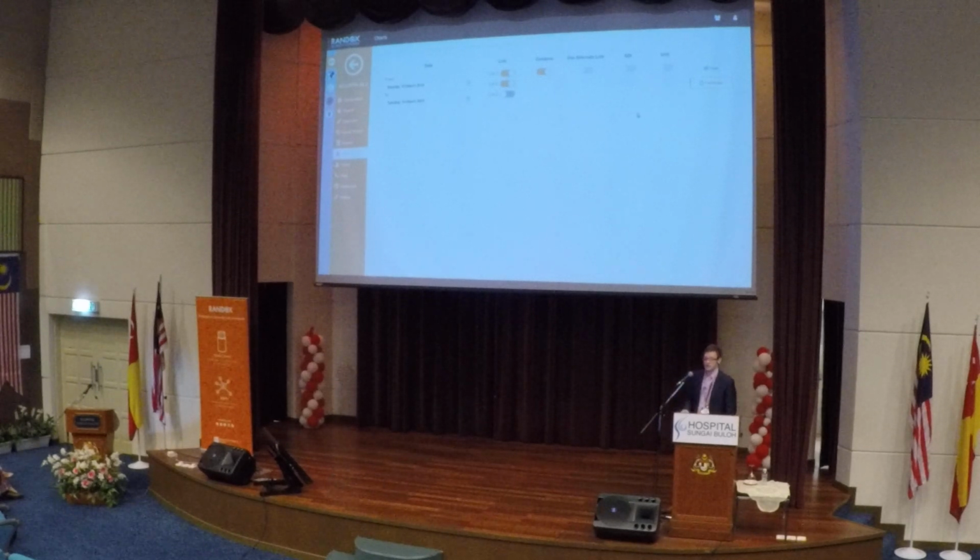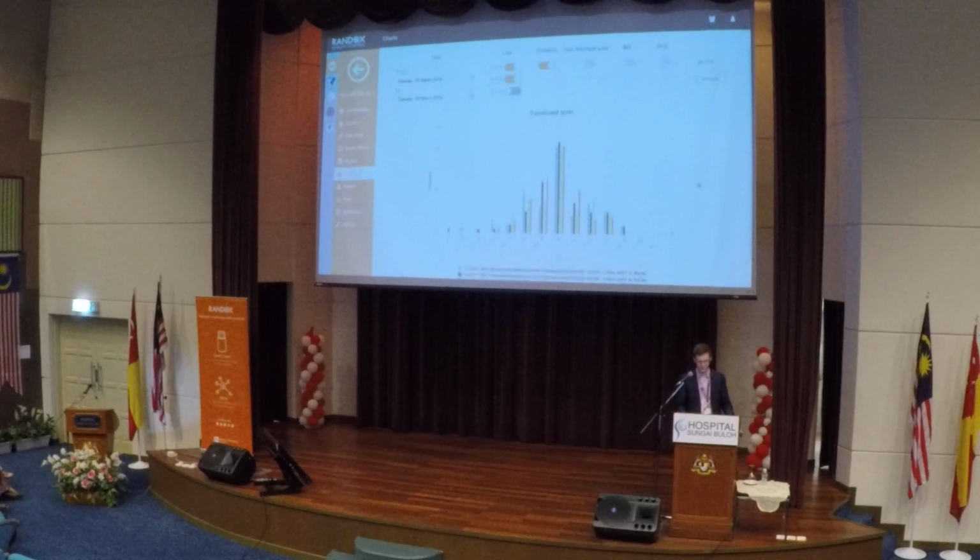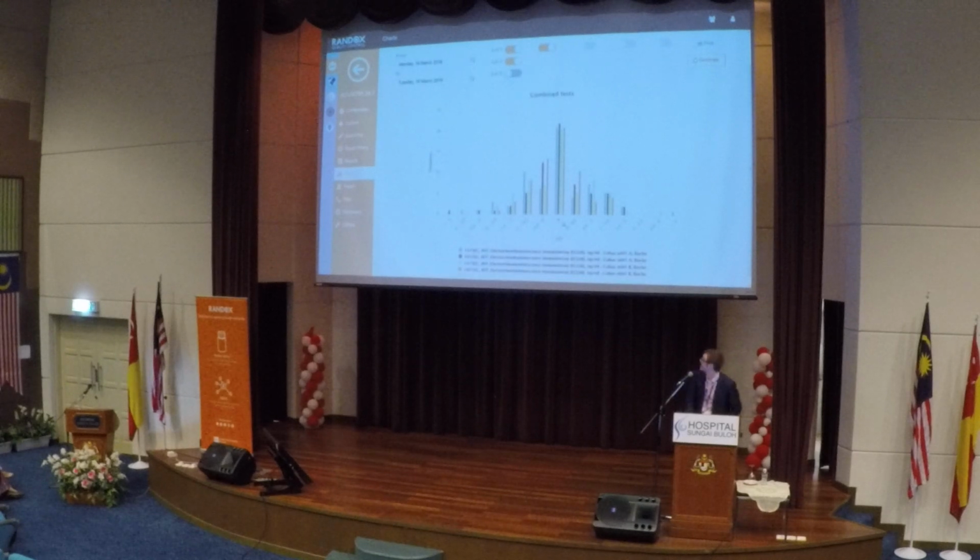Our histogram shows us the dispersion or the spread of our results around the mean value. If we zoom in a little bit, we can see all of our different SDI ranges or SDI brackets. For instance, we can see how many of our results have fallen between -2 and -1.5 SDI.